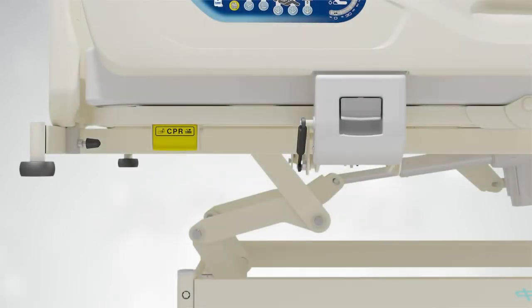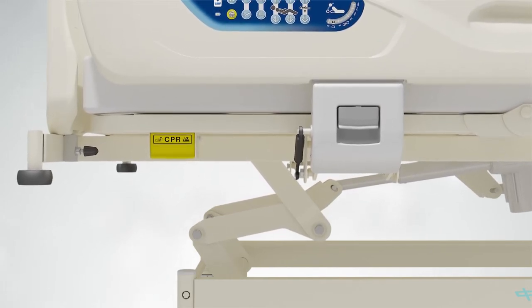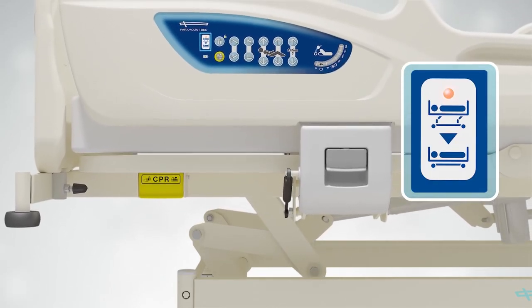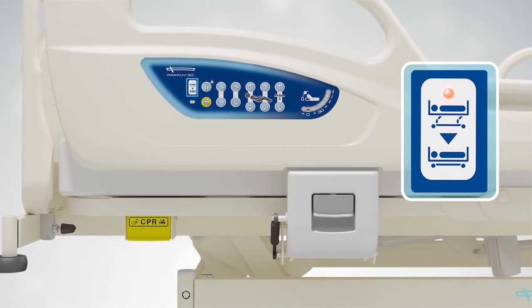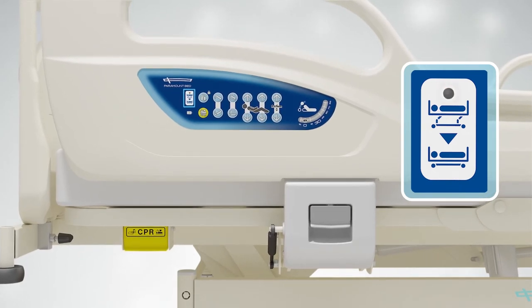The Paramount Bed A5 series comes installed with a low-height indicator, giving an extra layer to the security of the patient. The low-height indicator is a light attached to the side rail, and with just one glance, a family member or medical personnel can verify that the bed is safely locked in its lowest position.